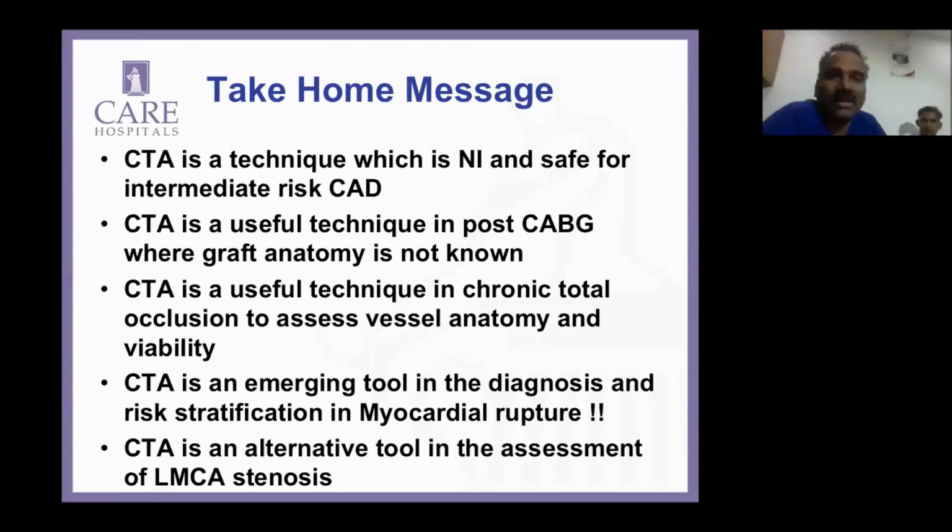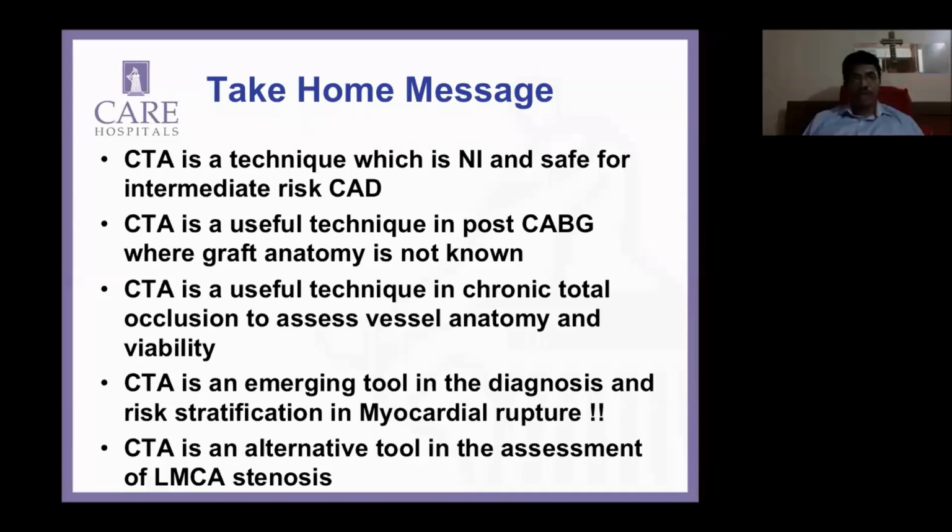But see, I would tell one thing. It's always better to see even the CT angio by ourselves. I think that's a very important point, and we have been doing workshops across the country, and I'm maybe going to take Sharat's help to do something here. We've been doing it all over the place, and I've got a dedicated team that comes and does these workshops with the help of GE or Siemens. And unfortunately, we don't get too many cardiologists in, but things are changing.